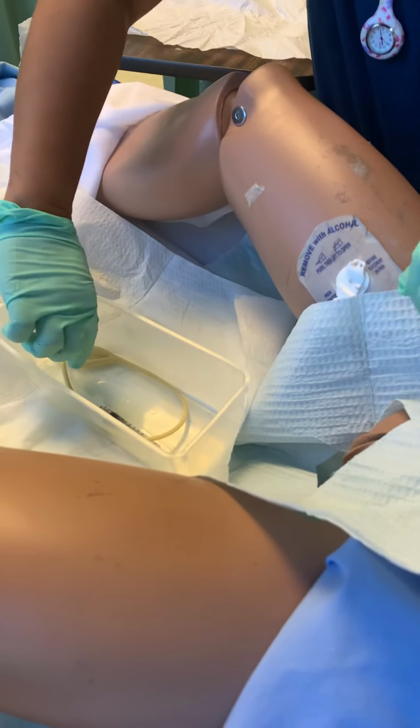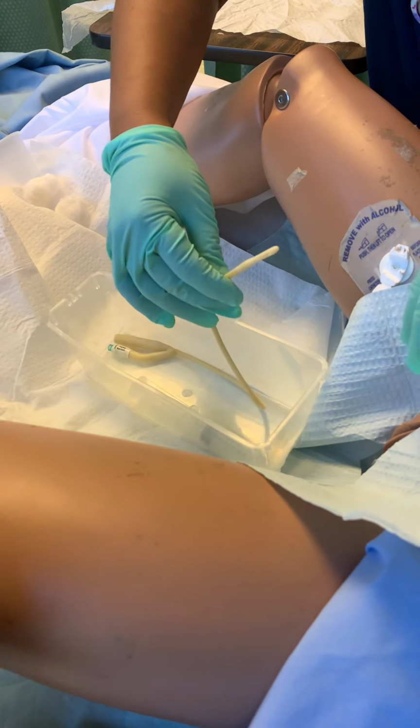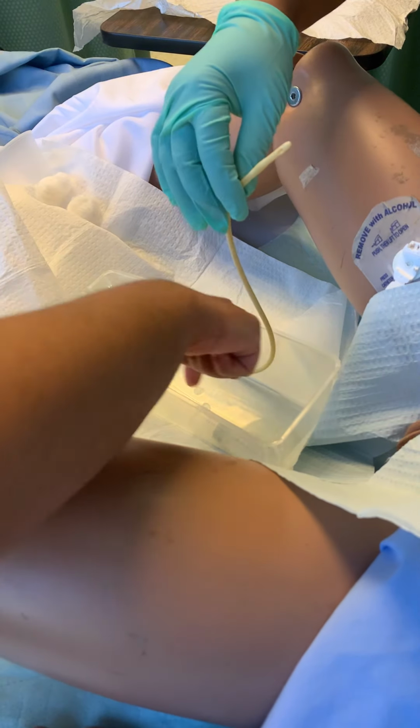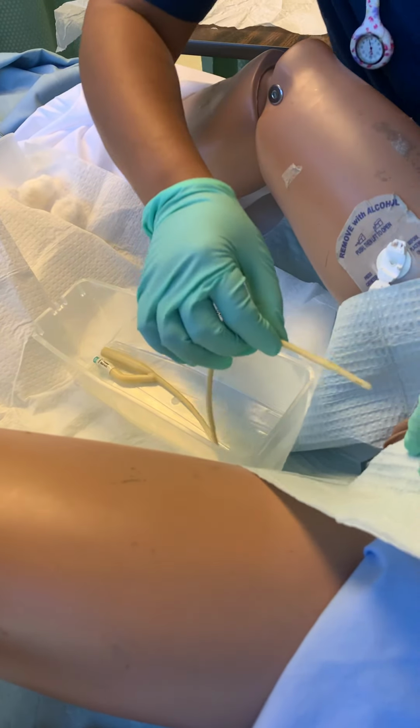Now I can start my catheter. Put it a little bit closer. You need to put this out first because the urine will come out, right?